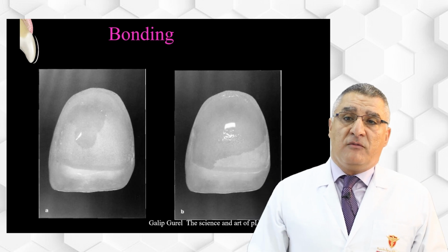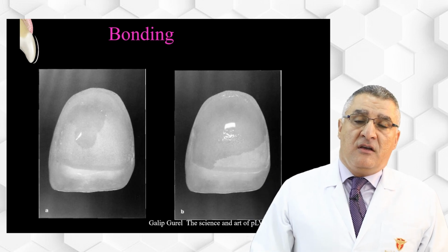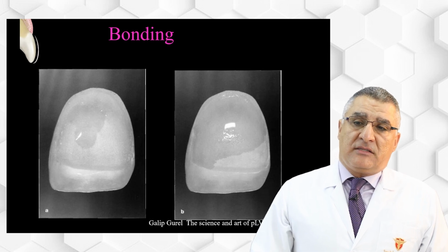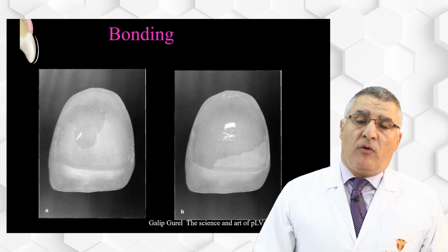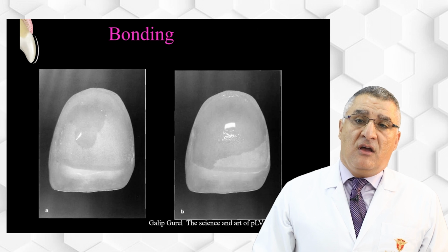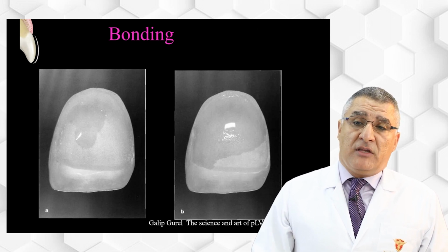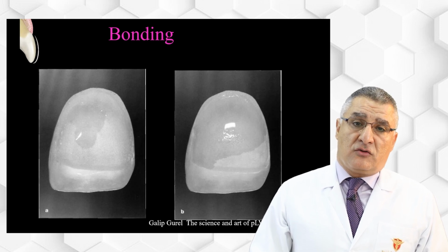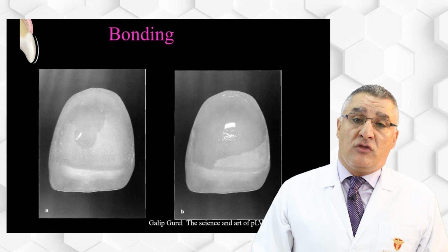Sometimes the veneer may come to you from the lab pre-etched. So how can we know that the ceramic is etched? By putting a drop of water inside the fitting surface of the veneer. If it spreads, it is etched, like on the right side. On the left side, the drop of water does not spread over the surface, so this means that it is not well etched.